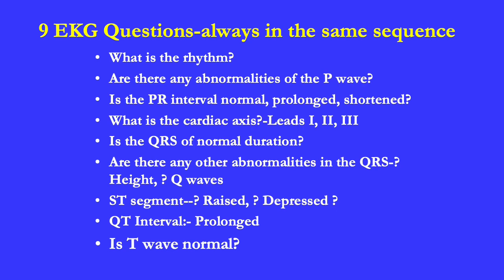And for QT interval, we look for prolongation. Very rarely we see a shortened QT interval. And finally, is the T wave normal?